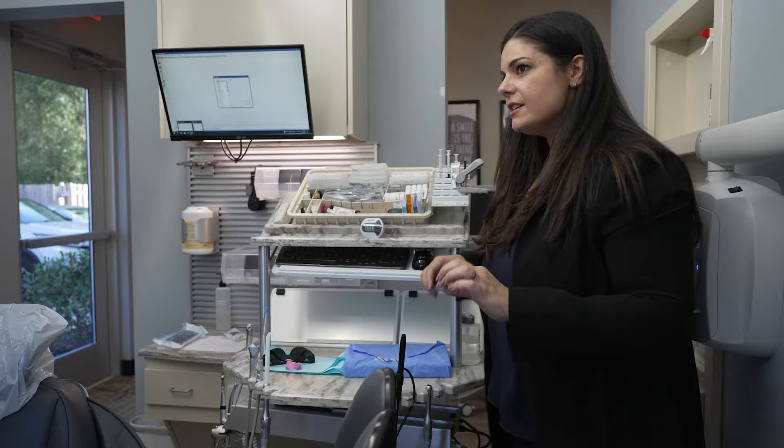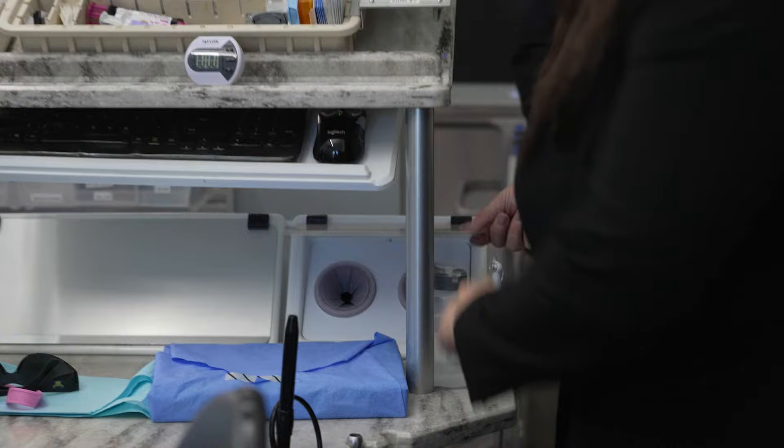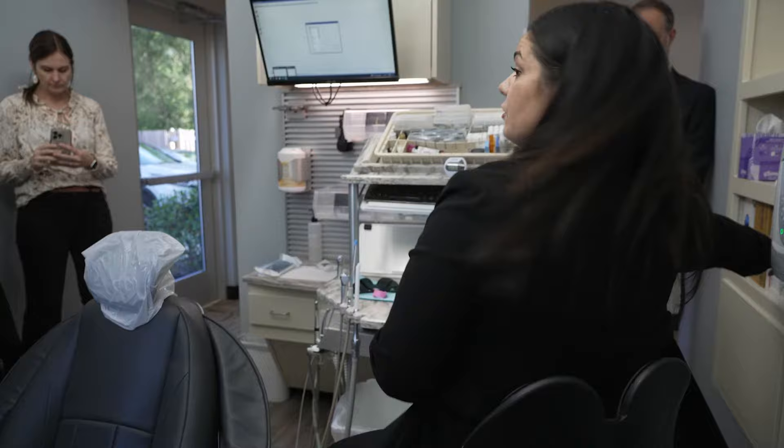Remember I said sterilization starts here? So your sharps can go here. And gauze — whatever your rules and regulations are — your trash is here. So if I drop something, pick it up, throw my glove away, grab a new glove, keep going without skipping a beat.